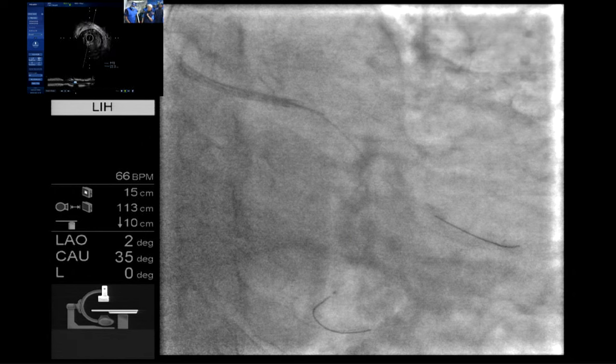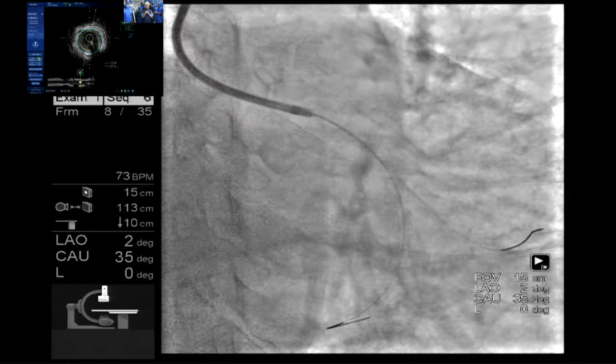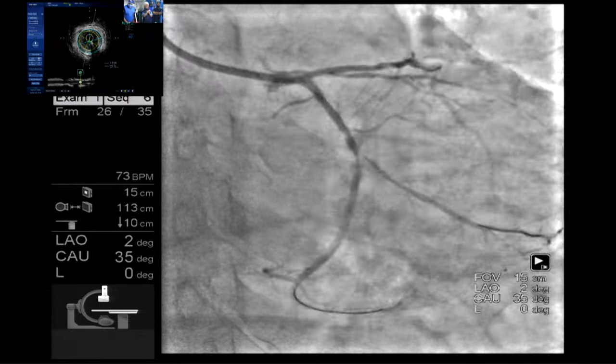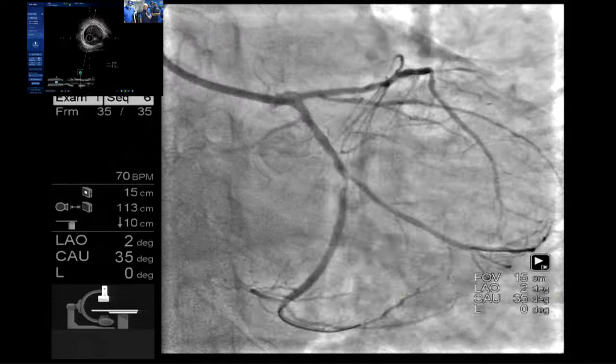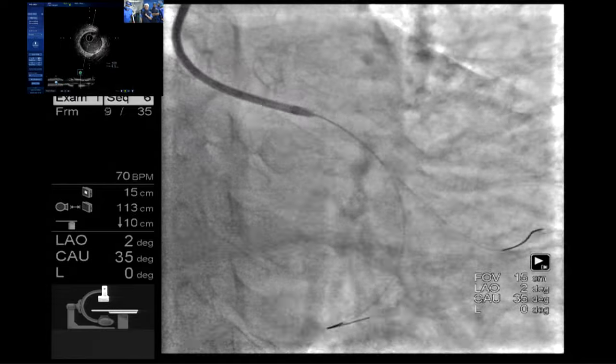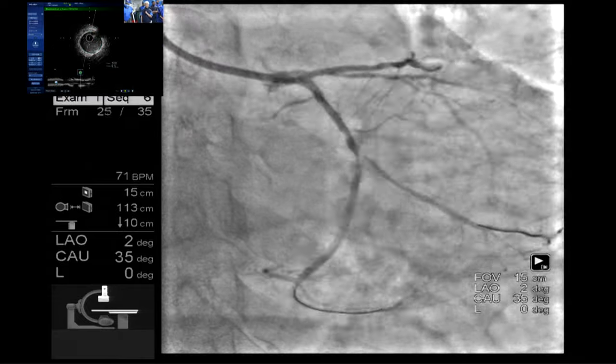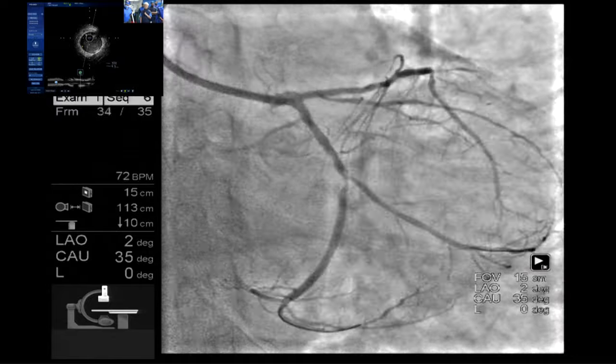Can I ask you, why 2.5 when your IVUS is saying 2.4 to 2.5, why not go a quarter size down and then dilate it up? Why go up front 2.5? What is the benefit? If we need to dilate more, 2.5 is easy to adjust. So the low pressure deployment to protect the distal dissection, and then pull back a little bit and higher pressure. I think we might save one step when you do a 2.5 stent. Looks like it's almost 2.5. So let's get a 2.5 stent.